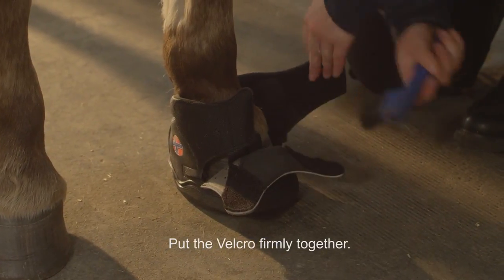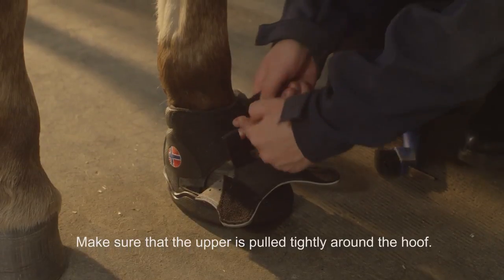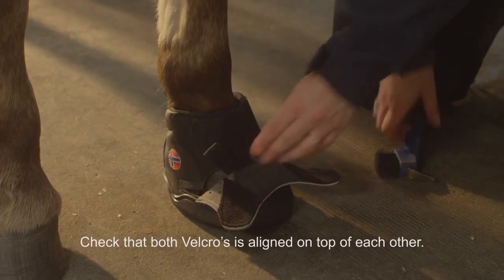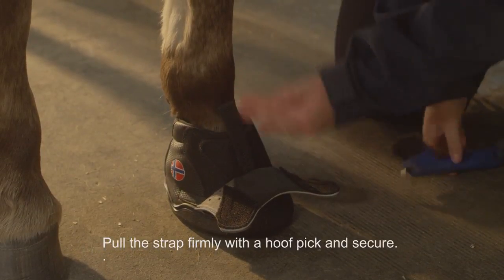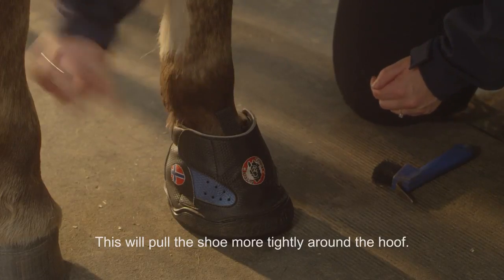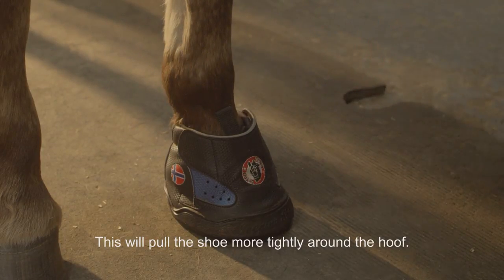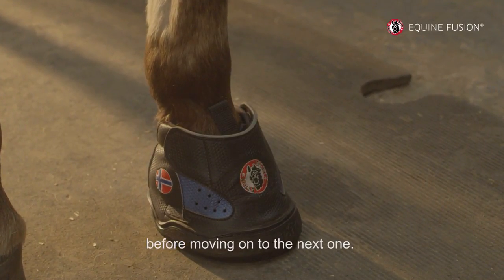Put the Velcro firmly together. Make sure that the upper is pulled tightly around the hoof. Check that both Velcros are aligned on top of each other. Pull the strap firmly with a hoof pick and secure. This will pull the shoe more tightly around the hoof. Check that the shoe is fitted tightly around the hoof before moving on to the next one.